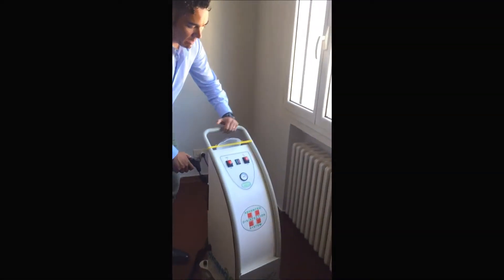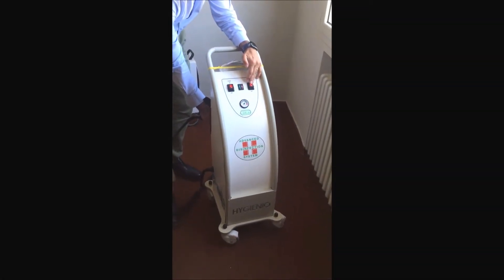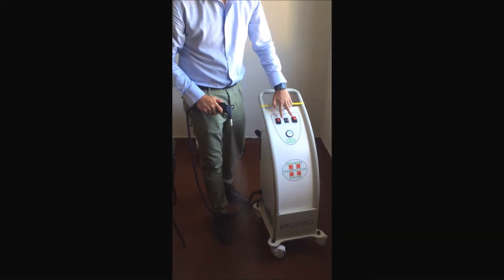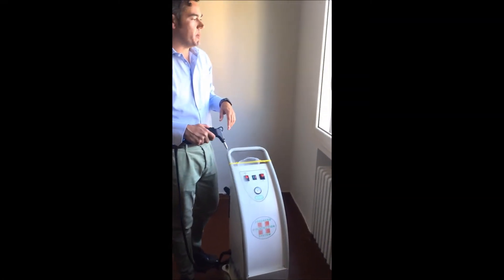I will now apply it. I will switch on with this button. What it is doing is injecting and mixing steam with the disinfectant solution. Now I have it like this, and at a distance of 40 centimeters, I apply it on the surface like this.